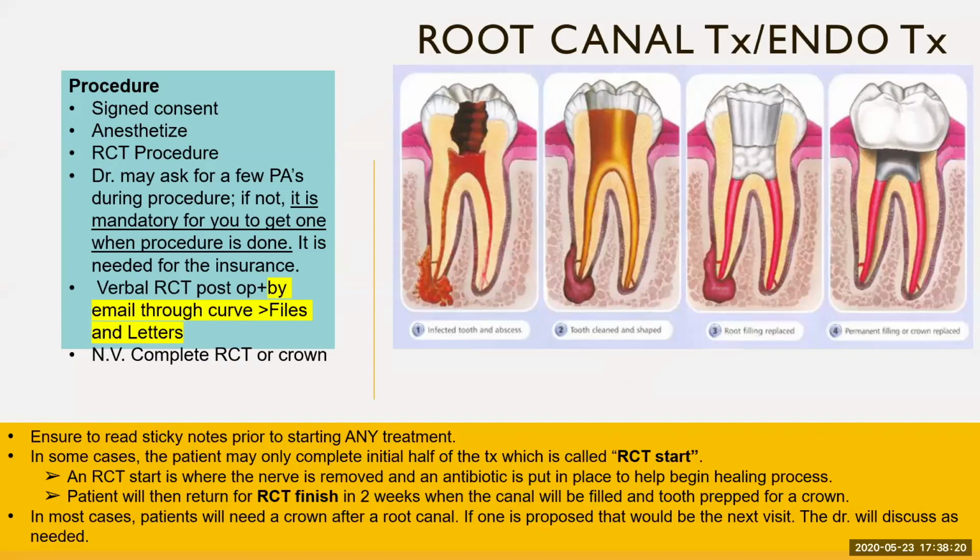Once the infection has been brought under control, the area around the root begins to heal. This usually happens once the dentist goes in and removes the pulp of the tooth. After the tooth has been cleaned, the canals in the root will be filled with gutta percha. And finally, once this is complete, the tooth will be crowned.